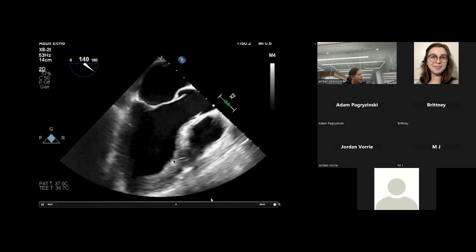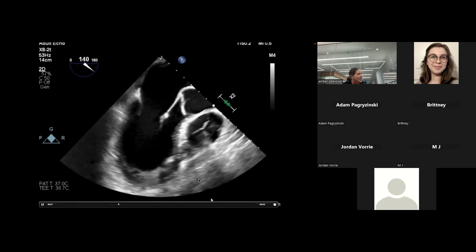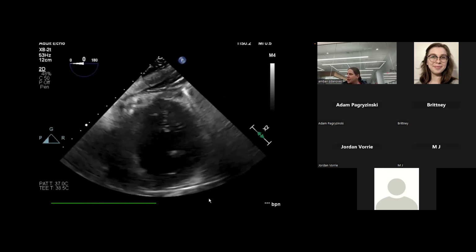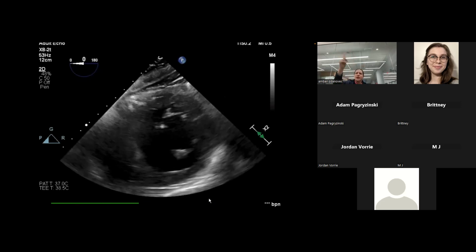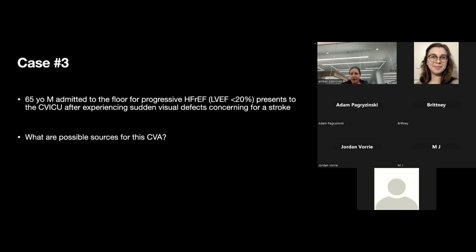So yeah, if you see something that doesn't look like your picture's foreshortened, but just in one area it does, it could be a thrombus. And I should have included the TTE pictures, but when they use contrast, it's really easy to see because you're just like, oh, there's this weird little filling defect right in that area. So yeah, this guy actually did okay for a while and then he came back and coded and died. But he had a bad heart. He was having some VT at the other hospital too, but I didn't want to make the case more complicated.